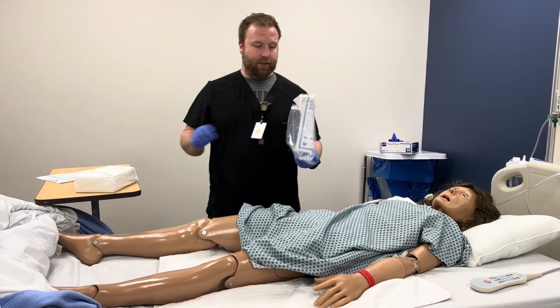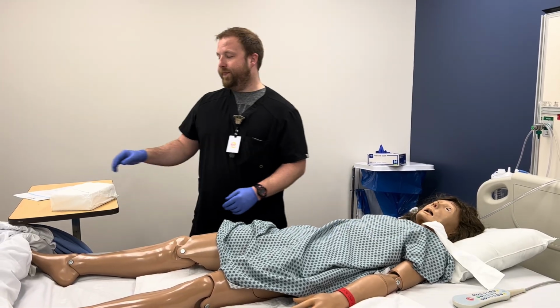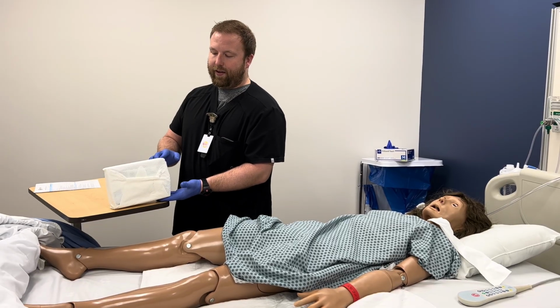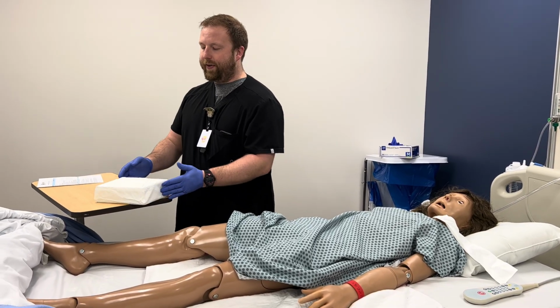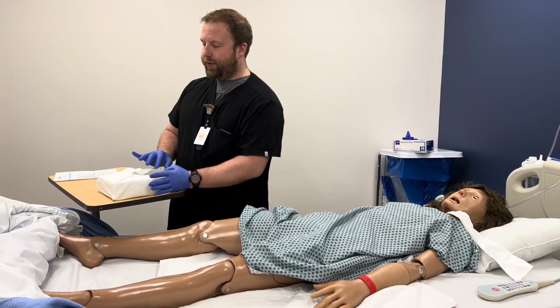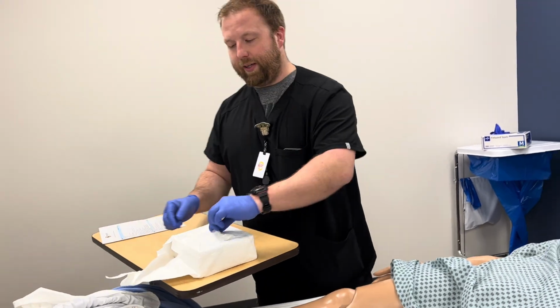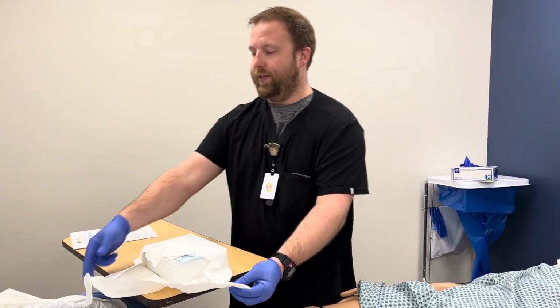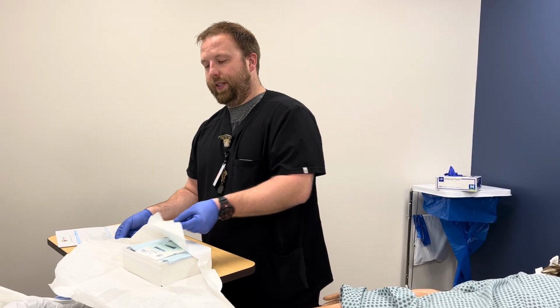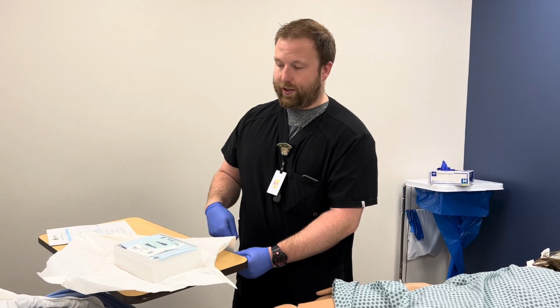And some people like to use the bag as a trash can. It doesn't matter. If you look, you can see that the top is folded a very specific way. You want to make sure that our first pull here is away from me. Then you're going to do both your sides. Make sure not to touch the inside. And then our last one is pulled towards us.